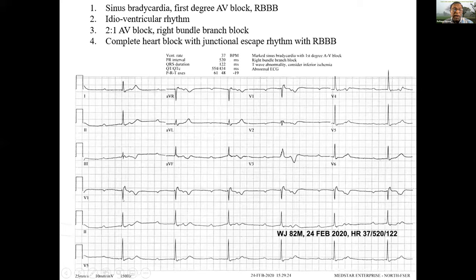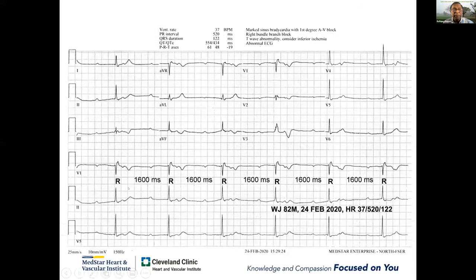Because you see, there is a P wave here. But if I look very carefully, the PR interval here is about 440 milliseconds, but over here it is longer. And then I did the timing. So I'm not going to do a question on this one. The RR interval is 1600 milliseconds. And then I put every other P wave. Look, it is changing now. The relationship is changing, 1640, 1650, the P to P interval, but the RR interval is independent. So there is no close relationship.